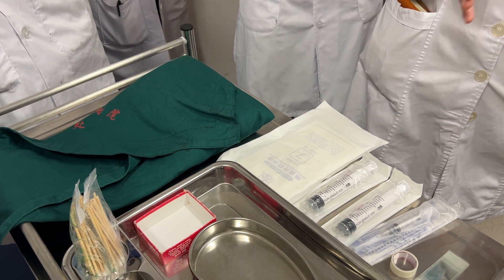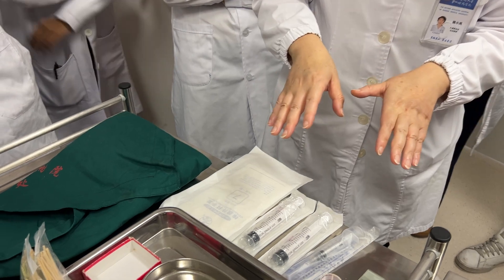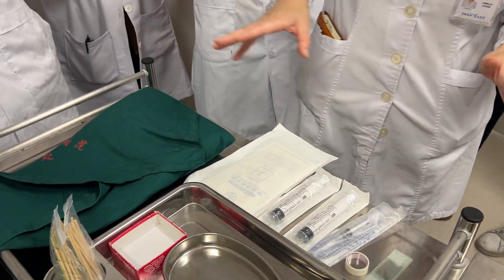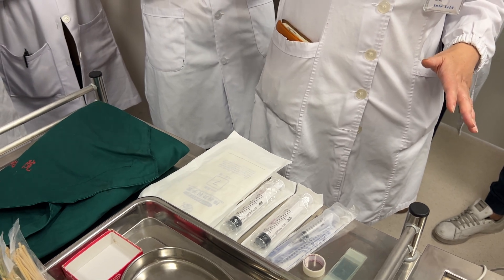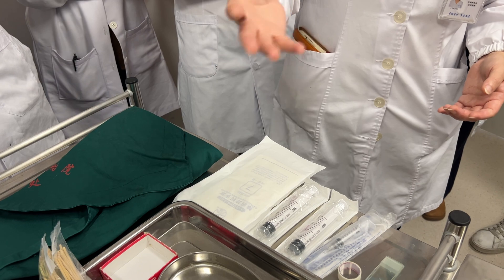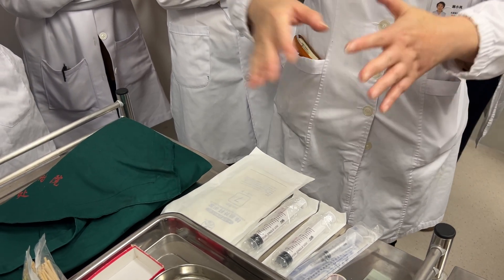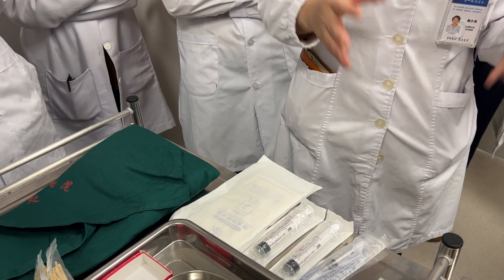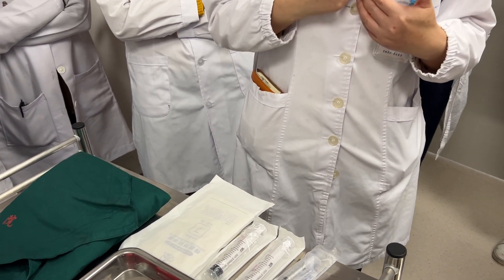In some conditions only one doctor performs this procedure, so you must prepare everything by yourself. But if there is an assistant to help you, you can ask them to assist. This time I will show you how to do the bone marrow puncture by yourself — only one person.